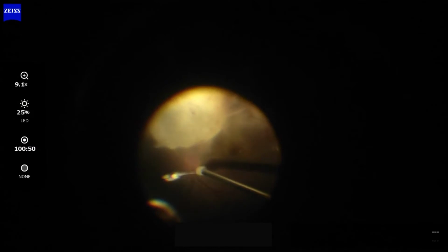After making 3 standard 25G pars plana ports, core vitrectomy was started. We could appreciate dense vitritis and the presence of a subretinal cyst with overlying exudative retinal detachment. After completing the core vitrectomy, triamcinolone crystals were put on the disc and an attempt to induce PVD was made.